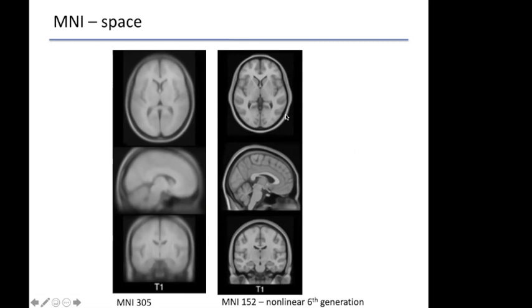So here we go. Why would you need to average multiple images? The question from Gina is why we would need to average multiple images to create a common space. The reason is that you don't want a single representation of the underlying anatomy. For a lot of the tools that we use, we do matching to local pieces of anatomy. I want to match the hippocampus as best I can, but at the same time, I want to match the ventricles and the cortical regions as best I can, right? So if you use one person as the underlying anatomy, how average is that person?